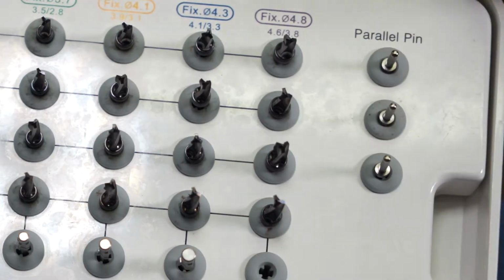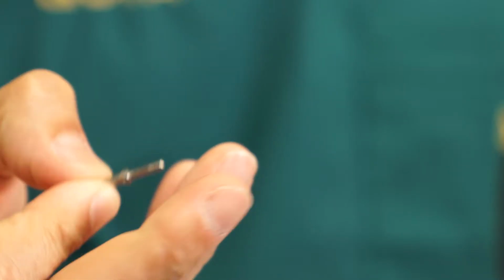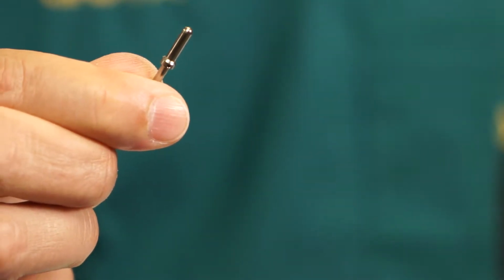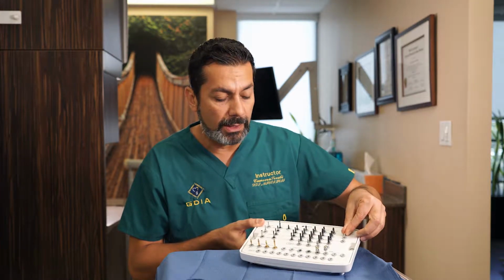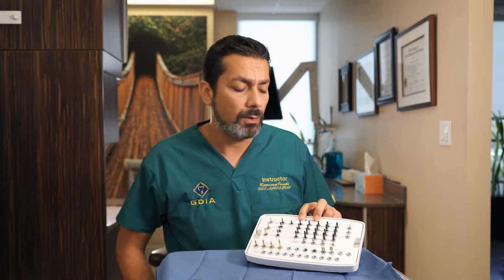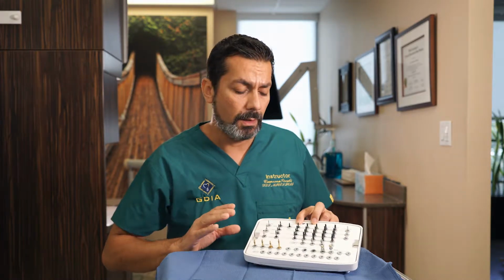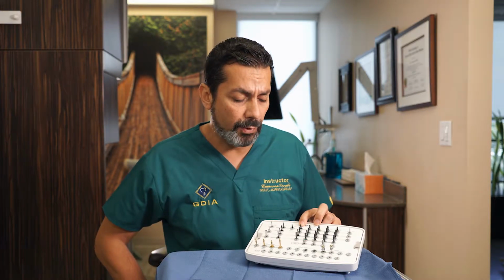At the end over here, these are your parallel pins. You have 3 parallel pins. On one end, the thinner end, is a 2.2 diameter, which corresponds to your 2.2 drill. On the opposite side is a 2.8 diameter, which corresponds to your 2.8 drill. So after your initial drill, you want to check the angulation or the depth of your osteotomy. You can put a parallel pin and take an x-ray, a working x-ray, to see where you are and if you need to correct your osteotomy at that point.